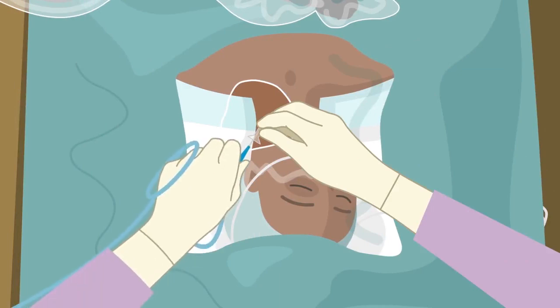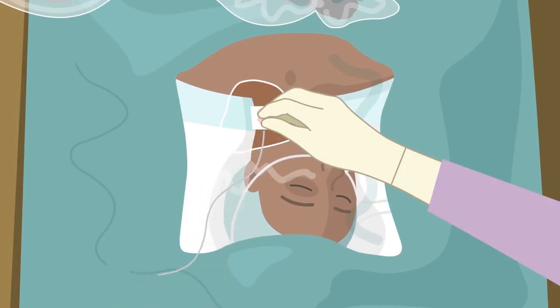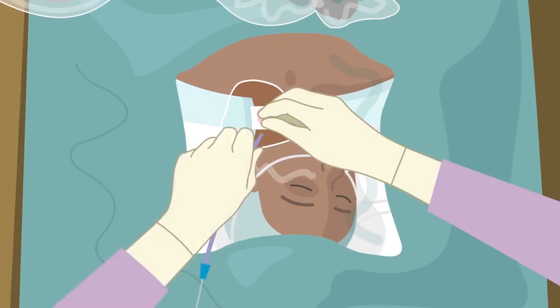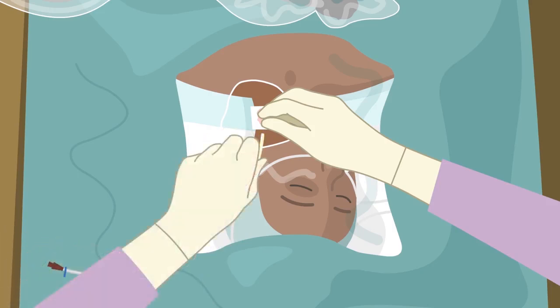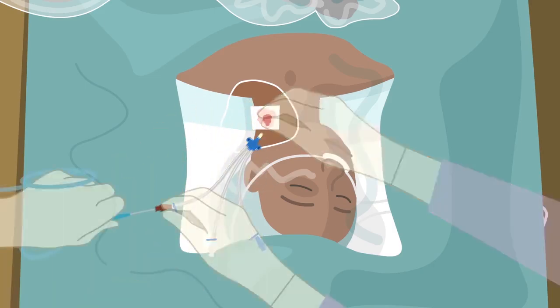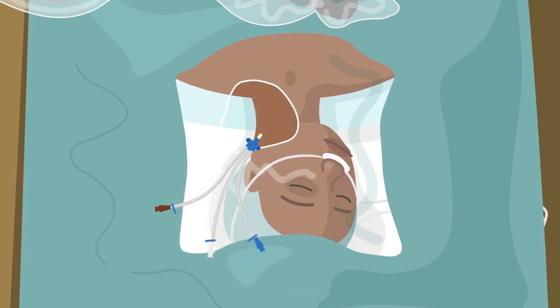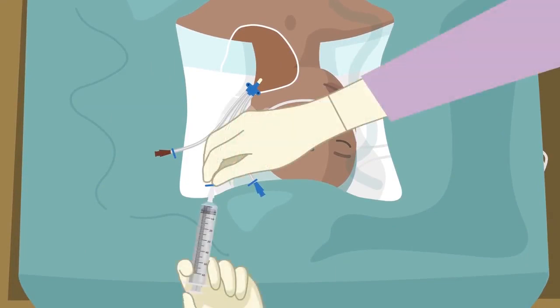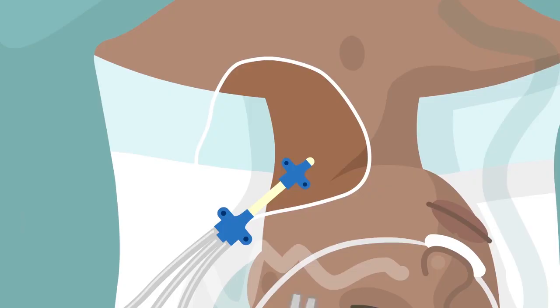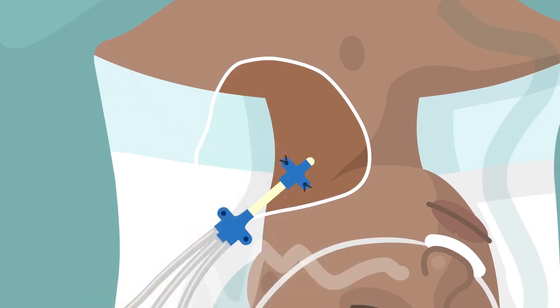The guide wire is introduced through the needle. After applying a small incision, the dilator is introduced and removed. The central venous catheter is then introduced over the guide wire. The guide wire is removed. Patency is tested by retrograde aspiration of blood in all lumens, which are flushed with 10 millilitres of sterile saline immediately. The catheter clamp is fixed with sutures. The clip is then placed on the catheter clamp and fixed likewise.